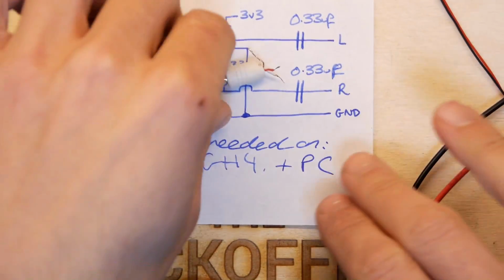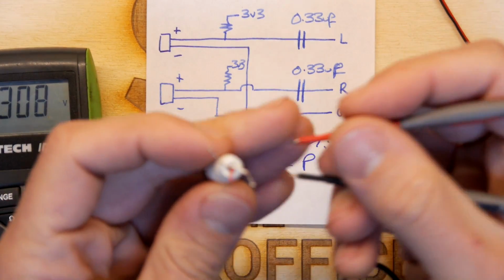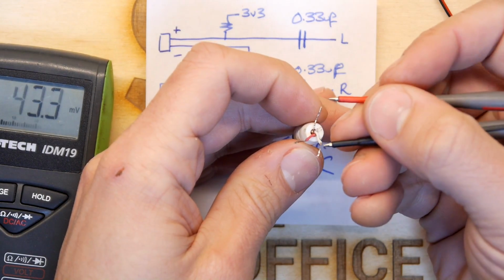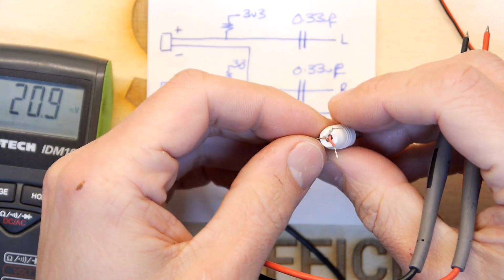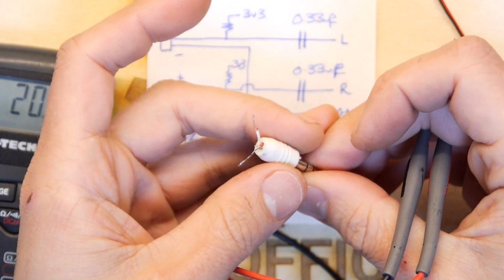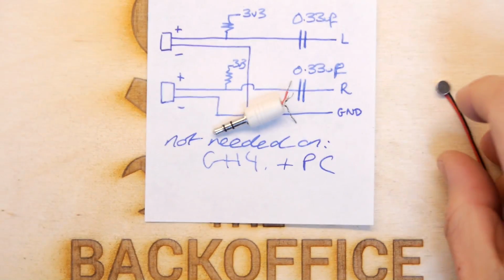So if you've already got a jack that's been cut down, plug it into your computer, and don't let the wires short. But if you take your voltmeter and measure between this ground and any of the other pins, so that one will be the left channel like this and one will be the right channel like this, if you see a voltage above 1 volt, it could be 1.2 volts, 2 volts, 3 volts, something like that, then your computer is actually providing phantom power, and that'll activate and amplify the microphone because there's a little transistor in here that's acting as a small amplifier. And that's perfect, that's what you need.